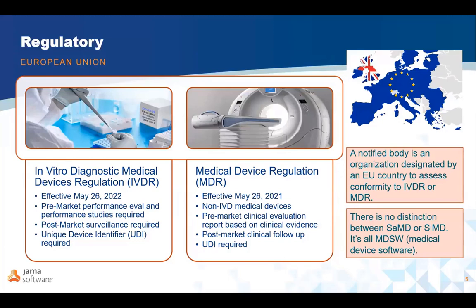You'll need to consider if the software you are developing is an accessory to a medical device, or is it a medical device on its own? If it is an accessory, it'll need its own technical file. If it is sold as an integral part of the system, it should be included in the system's technical file.